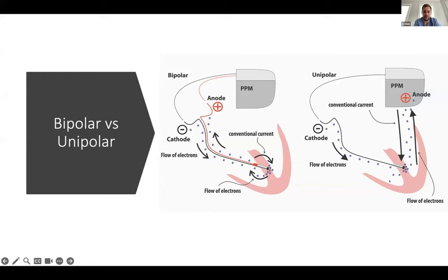Sometimes, like epicardial leads, for example. But for a unipolar, any time you have a circuit, you'll have a cathode and an anode, and your electrons are going to be flowing from your cathode to your anode to complete the circuit. So when you use these leads, you're just extending the loop of the circuit out. Your cathode will be the tip of the lead in a unipolar, and it's going to be flowing to the anode. In this case, it'll be flowing to the can, which closes the electrical circuit. Electricity is always looking to find balance, so closing the circuit is how it finds that balance.